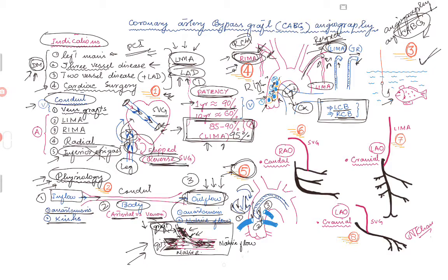As I said, the surgeons have distorted anatomy. They might have put the graft somewhere. All you have to do is just fish around, move the catheter up and down, and then clock or counterclock to find or hook on to a graft. Of course, when you are doing this, you do tend to have a small risk of stroke. You can scrape a plaque, and that can go into the carotid arteries, especially when these patients are older. So with that, we come to the last three pictures.